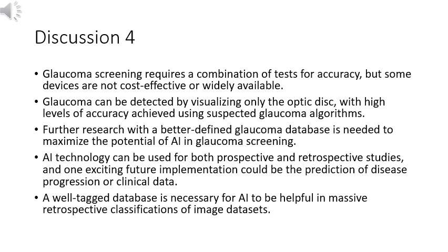Although we use data augmentation techniques in order to improve validation accuracy, having a large dataset could be very important for obtaining a robust and more general prediction model. We believe false positives could be avoided with larger and better tagged datasets. In our case, the main cause of false positives and negatives were borderline cases, images with which even retinal specialists have low inter-observer agreement.